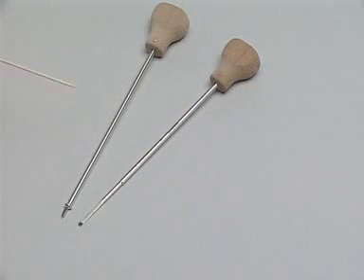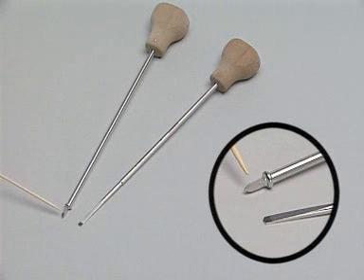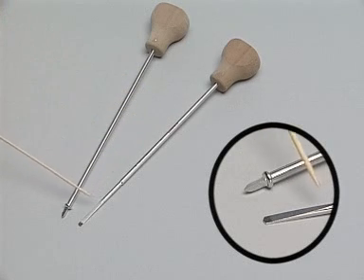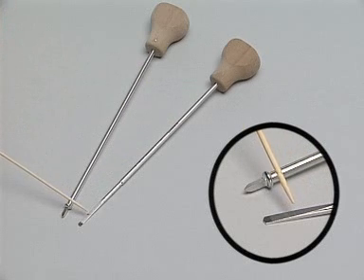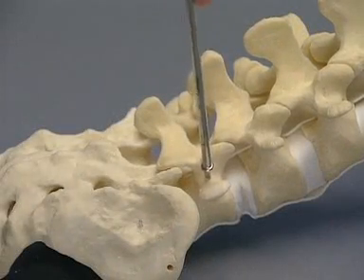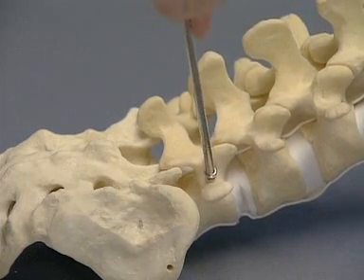The instruments used in opening the pedicle are the USS Pedicle Awl and the USS Pedicle Probe. The pedicle screws are inserted in the usual manner. The hole is started with the pedicle awl and completed with the pedicle probe.